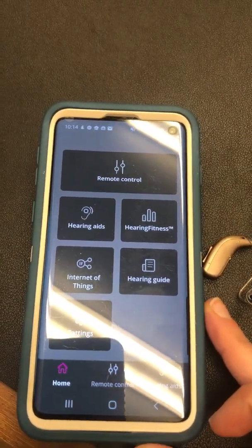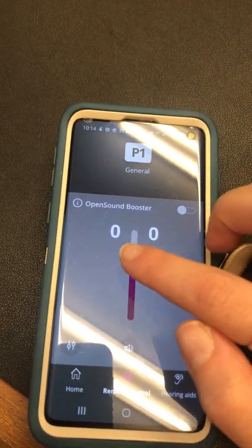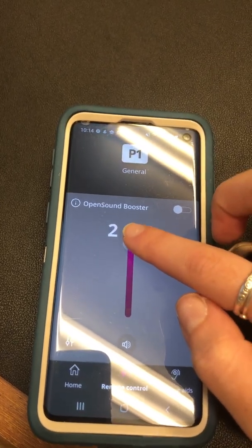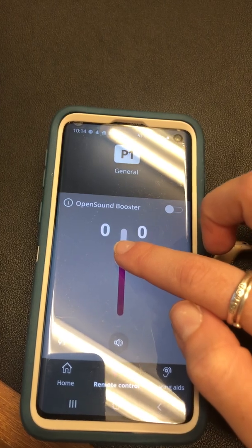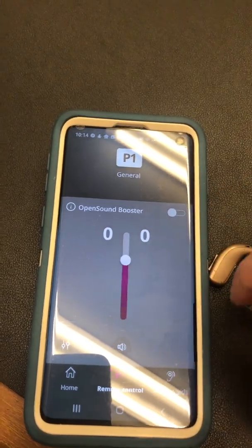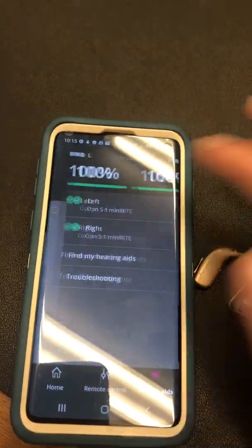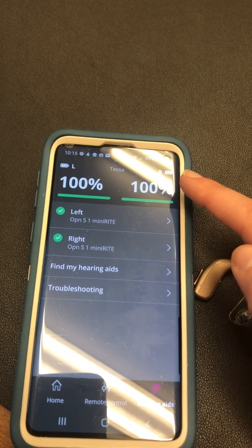The most useful thing we want to do is use the remote control. Here you can control the volume — you can go up in volume and you can go down in volume. Zero is where we have you set. If you go home you can check your hearing aids and see the battery level as well.